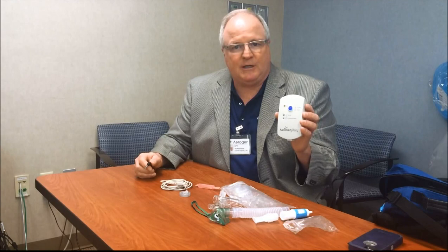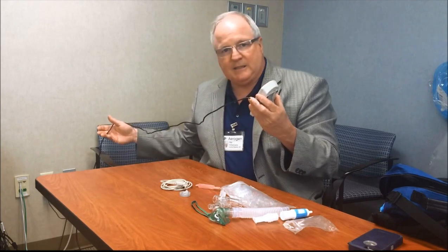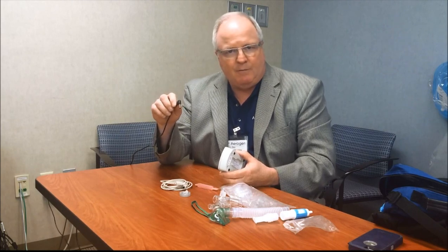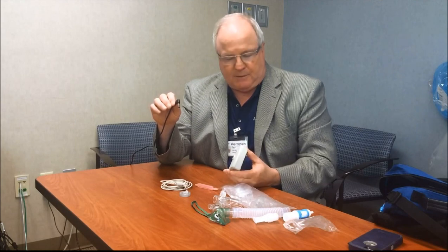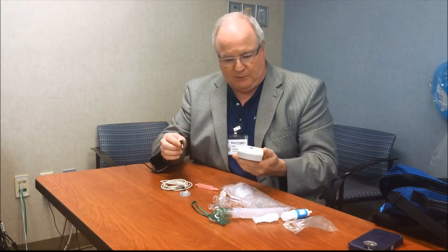It has to be plugged in order for it to go to the continuous mode, and that's another part of the component. If you look, you can see there is an AC/DC adapter. We recommend you keep it plugged in at all times. It will operate under battery power for about 40 minutes on a full charge, 40 to 45 minutes, but typically that's reserved for a quick transport or if the lights inadvertently go out in the facility.